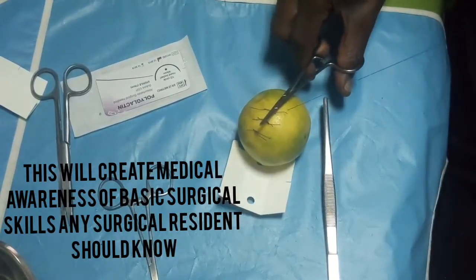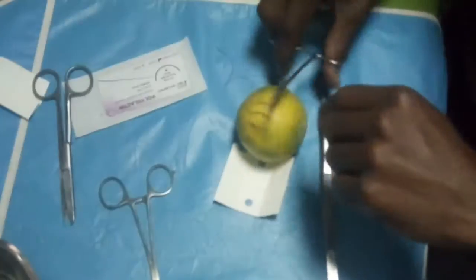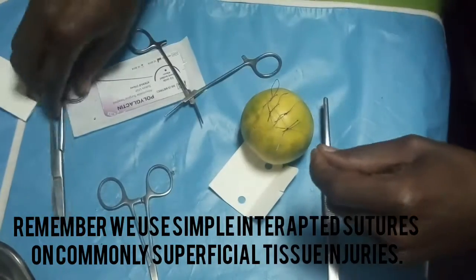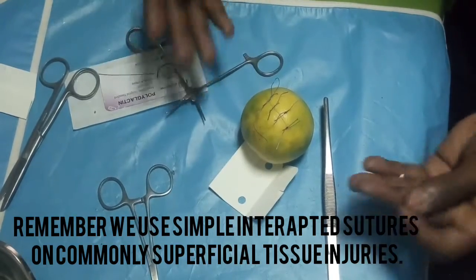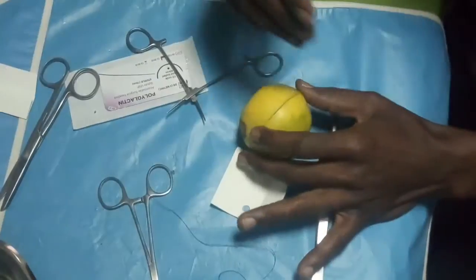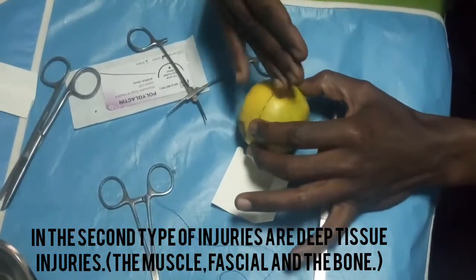And now we complete our simple interrupted suture, which we use in superficial tissue injuries. If a patient has just appeared with a superficial injury, just use a simple interrupted suture. But if we move forward to the deep tissue injury, like muscular tissue injuries, then we are going to use a different pattern.